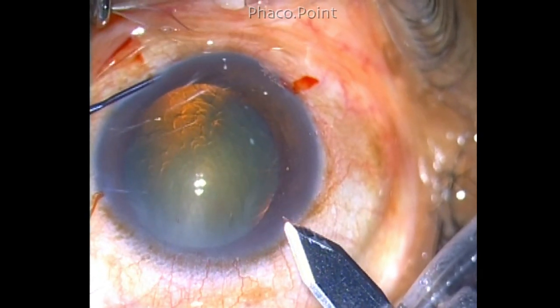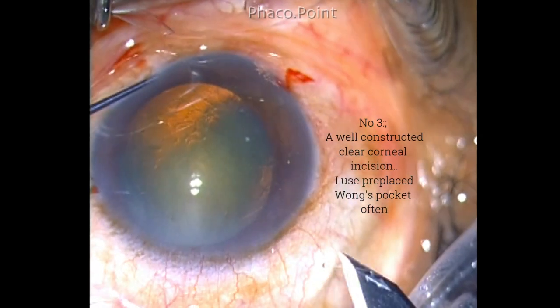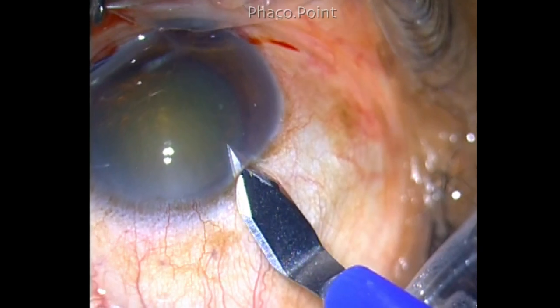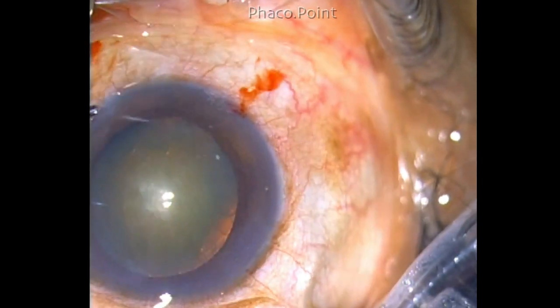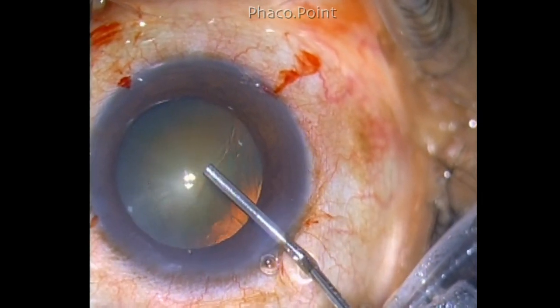In this case I am creating the Wong's pocket first and then the main corneal incision underneath that. This Wong's pocket will help me to close the clear corneal incision if I encounter any problems. So this is a pre-placed Wong's pocket incision or stromal hydration incision.